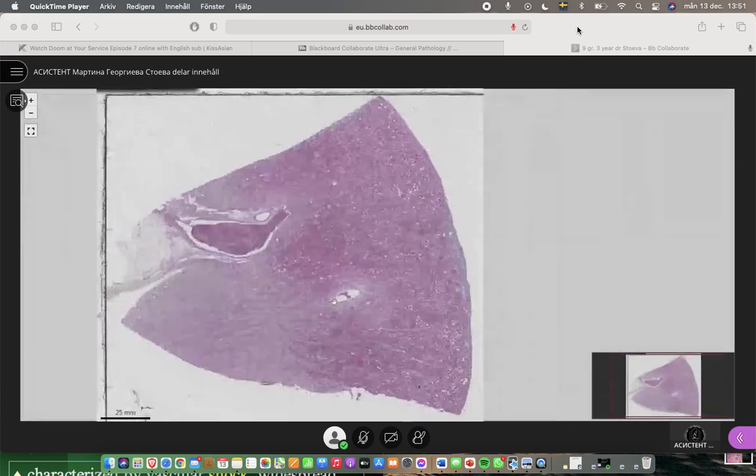Otherwise, for the slide, if you make the correct diagnosis amyloidosis, then theoretically, you can be asked about the types of amyloidosis, the special staining, of course, and so on. Questions?